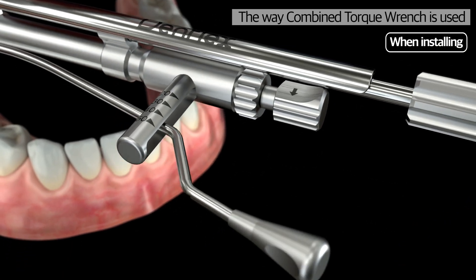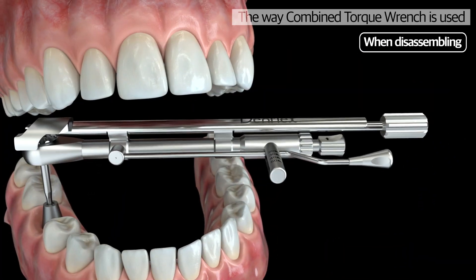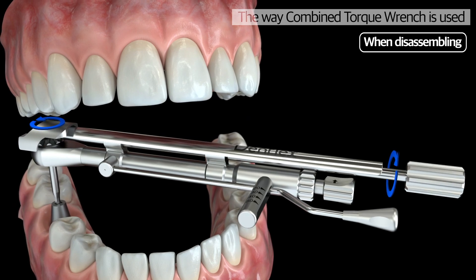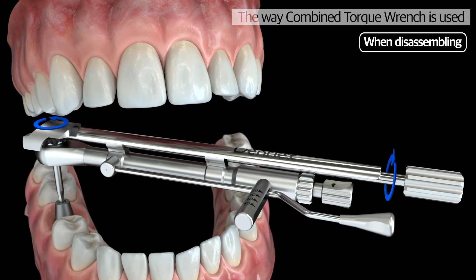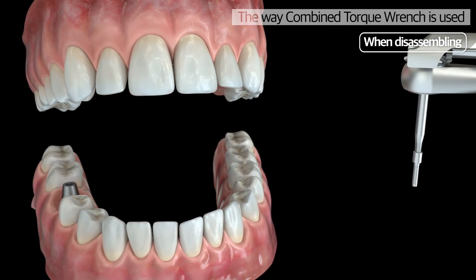Changing the direction of usage for installation and disassembling is easy depending on the user's preference. The ease of disassembling through rotating the torque wrench counter-clockwise and rotating the part on the hand driver the opposite way reduces the discomfort of patients and practitioners.